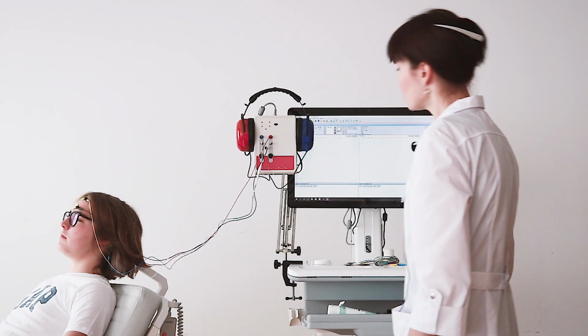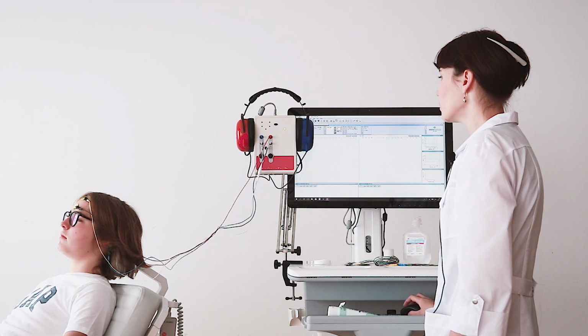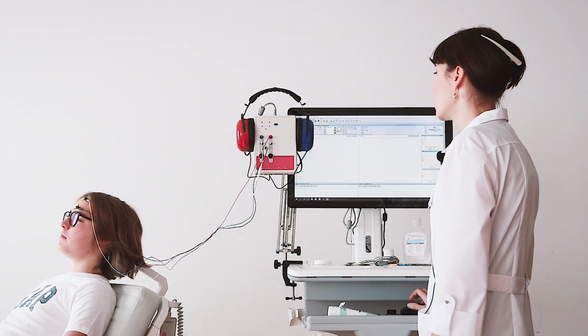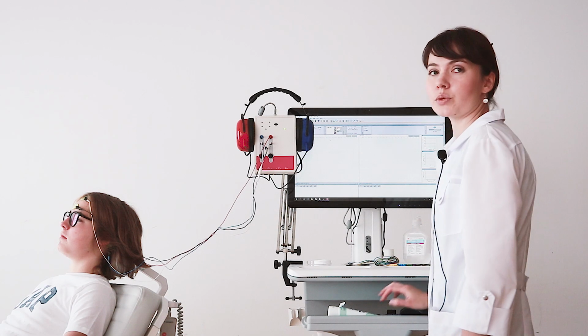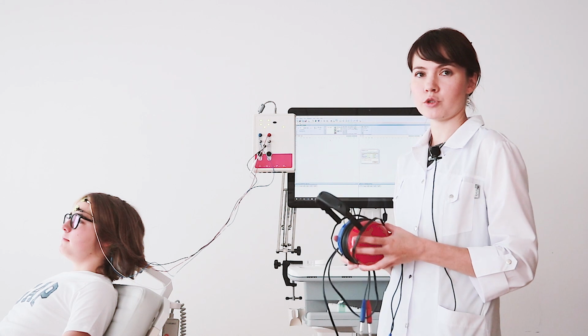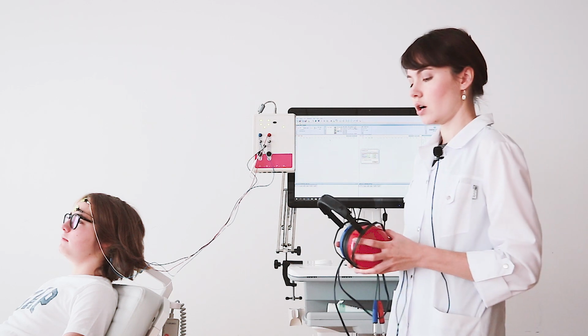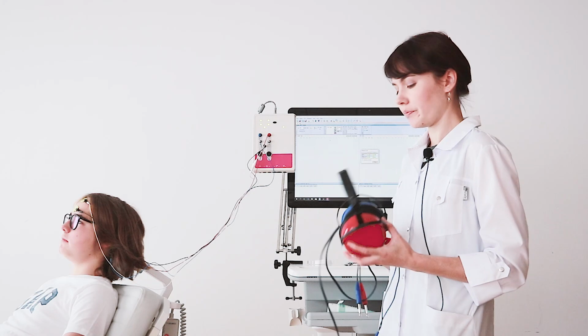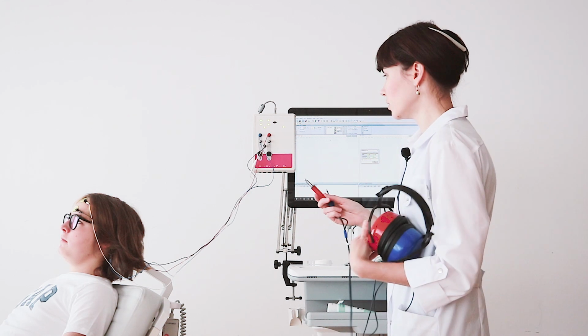After positioning the electrodes, we need to check their quality by pushing the impedance button here in the program or on the main front panel of our amplifier. As we can see, our impedance is good enough. We close this window and now we need to put a stimulator on the head of our patient. In this test, as the stimulator, we will use the headphone stimulator. Also, you can use insert earplugs as the stimulator. To connect the stimulator to our amplifier, we use a connecting cable.